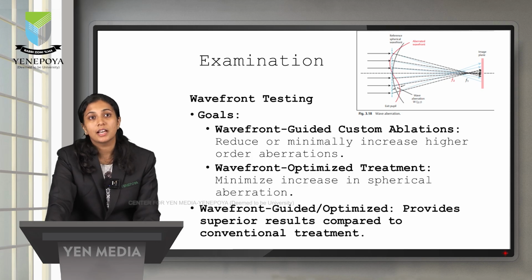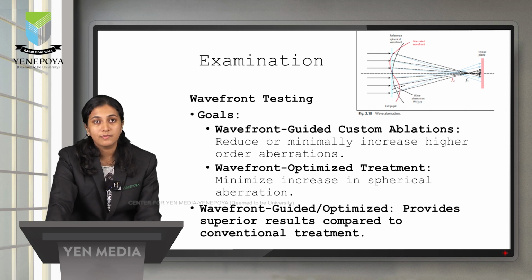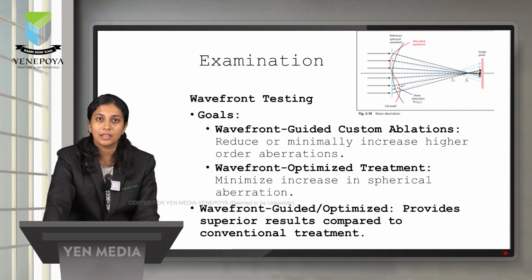Wavefront testing has to be done because it always gives a superior result to conventional therapy. Now patients will have lower order and higher order aberrations. Post keratorefractive surgery, the lower order aberrations would reduce, but there might be an increase in the higher order aberration which can reduce patient satisfaction. So if you go with a wavefront guided or wavefront optimized treatment, you can at least minimize the increase in the spherical aberration.